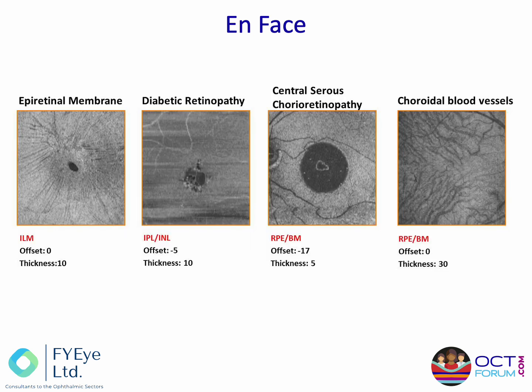So in these examples, we can see how en-face helps us locate many lesions rapidly across the posterior pole. So at the layer of the inner limiting membrane, on this example, we have what we call macular pucker. We can see traction lines from an epiretinal membrane and also a pseudomacular hole. At the level of the inner plexiform inner nuclear layers, we have early leakage from capillaries in diabetic eye disease, and we've got fluid there building up.